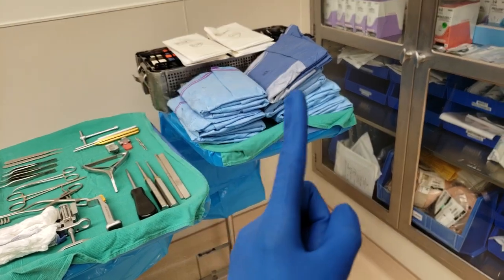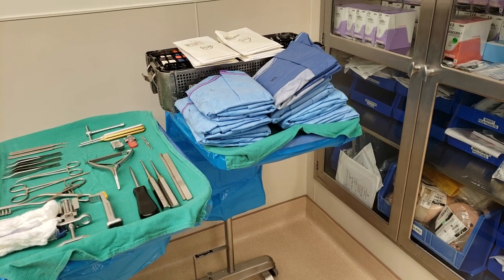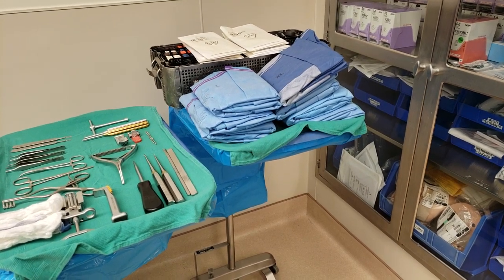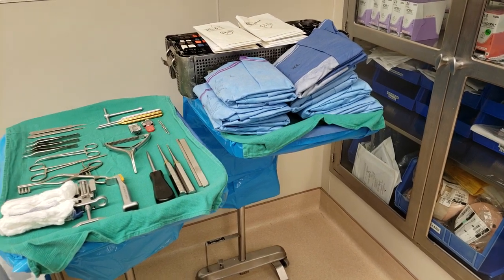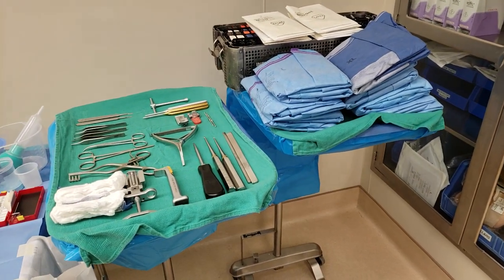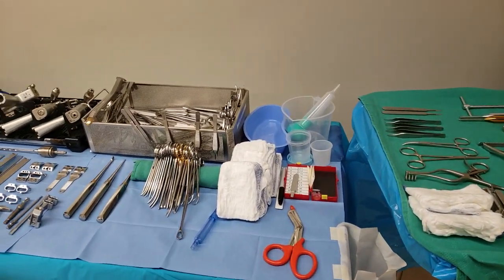And as you can see, there's a lot of people involved in this case. There's gonna be the surgeon, then 3 podiatry residents, and then me. So plenty of people, plus x-ray, plus the nurse, plus the rep. So you kind of have to work with what you got.